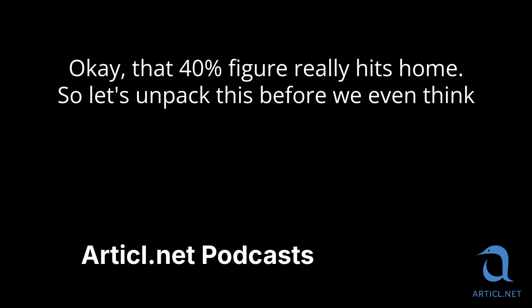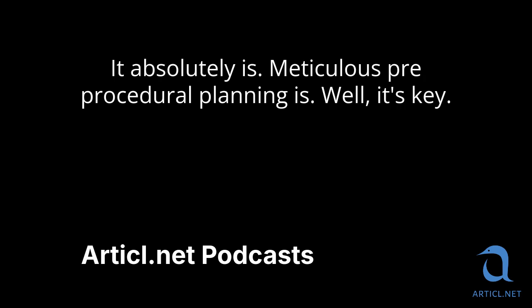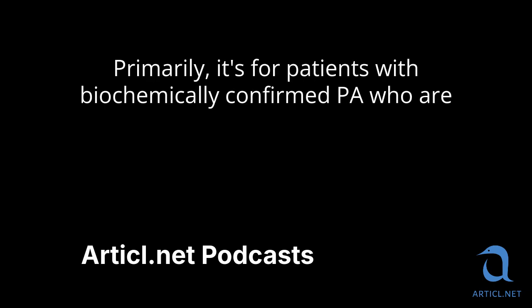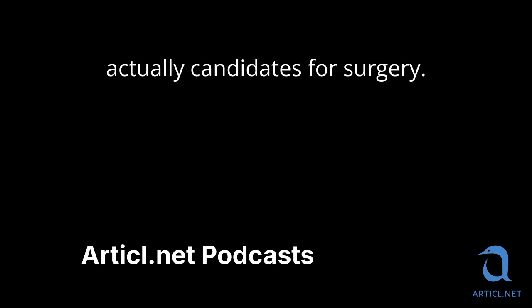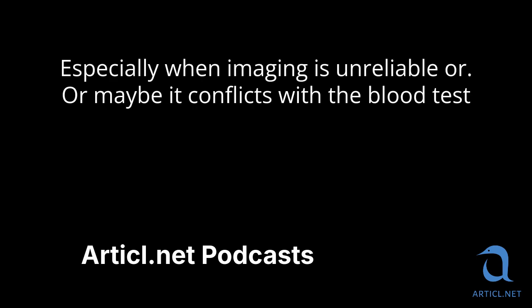So let's unpack this. Before we even think about picking up a catheter, what's the blueprint for success in AVS? Setting the stage correctly seems paramount. It absolutely is. Meticulous pre-procedural planning is key. So first up, indications. Who gets AVS? Right. Primarily, it's for patients with biochemically confirmed PA who are actually candidates for surgery. Makes sense. We use it to distinguish unilateral, one-sided, versus bilateral, two-sided causes, especially when imaging is unreliable or maybe conflicts with the blood test results.